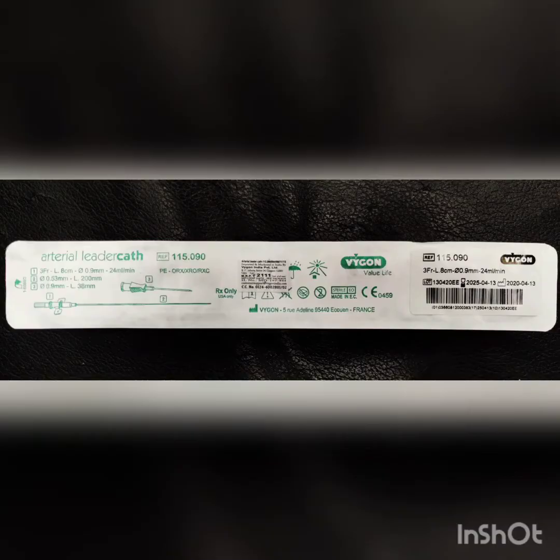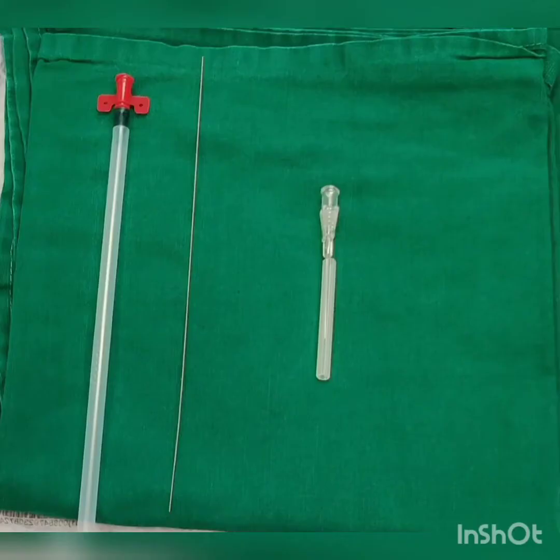Some people may use a 20-gauge gelco and others may use a pre-packed sterile arterial catheter kit which consists of a stainless steel introducer needle with tapered hub, a guide wire with a flexible straight tip and a smooth surface, and a smooth flexible catheter with a special tip for easy insertion and fixation wings at the proximal end.